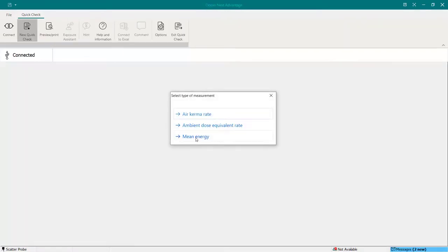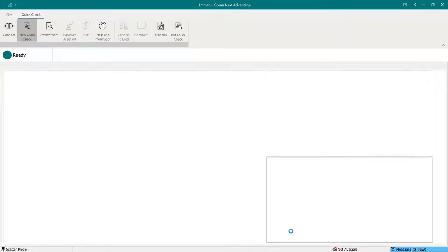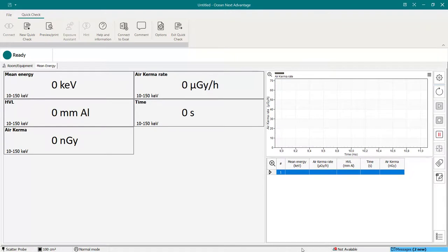The last one is for mean energy. For some scenarios, there is a possibility to measure the mean energy in kilo electron volts. That's the mean energy, not the acceleration voltage itself, and the HVL.